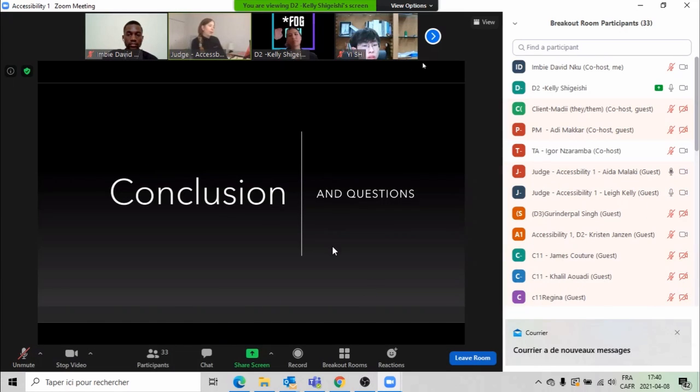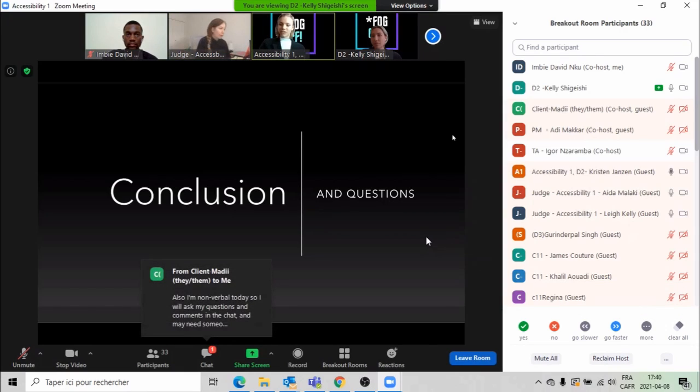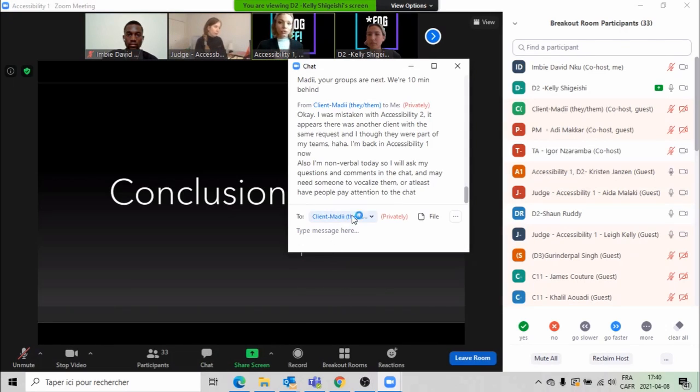Yeah, I'll go with the first one. Is it washable? Yeah, so it's a medical grade silicone adhesive. It's actually the same material used in those strapless, backless bras and a lot of other cosmetic or clothing sticking materials. So it's simply washable with soap and water. You run it under the sink.